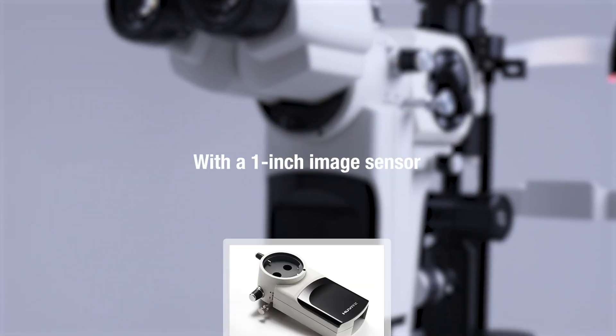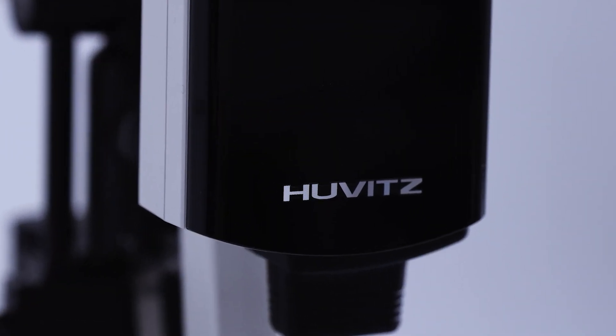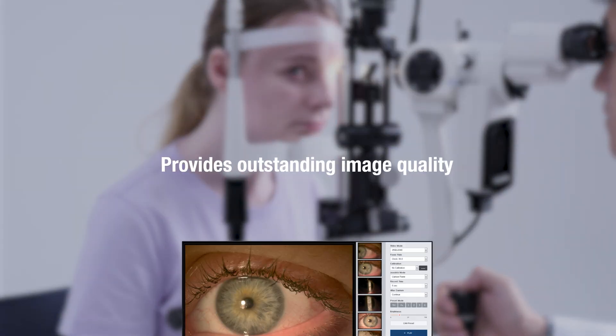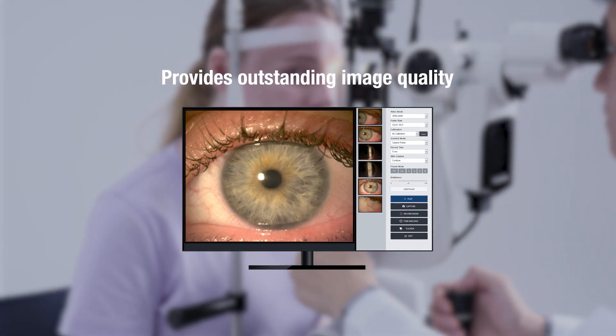During shooting, the light is adjusted to be darker, allowing for the verification and capture of the highest quality video.